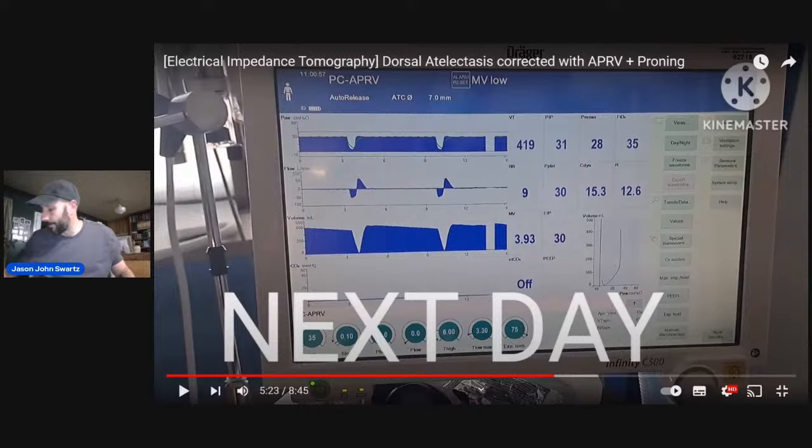And what else are you asking here? So when she was on volume AC, what were the volumes? So I got, like, don't forget, this is while I'm working. So the decision was I'm putting the PulmoVista on, see what's happening. PEEP is at 8.